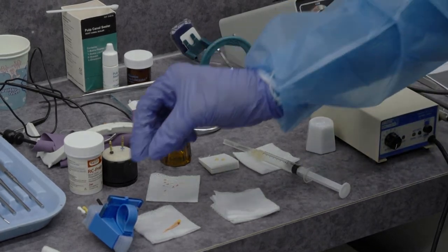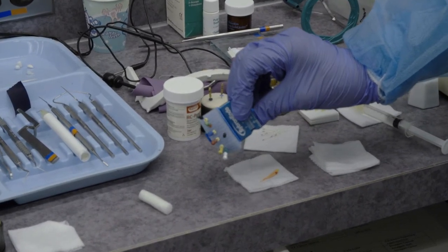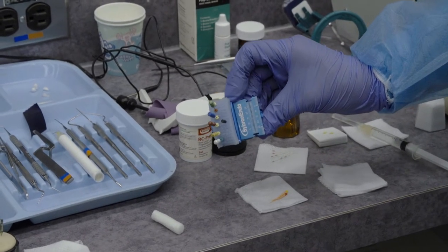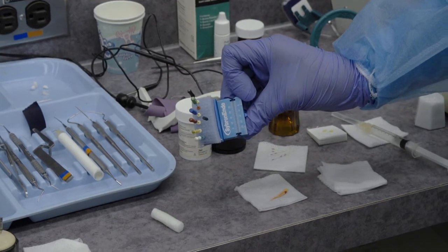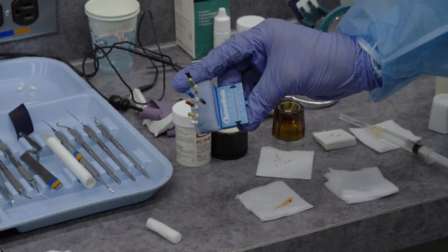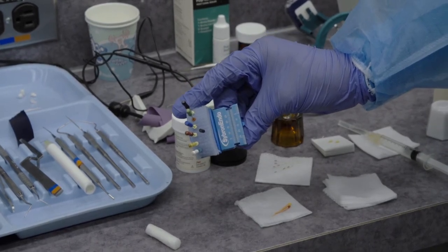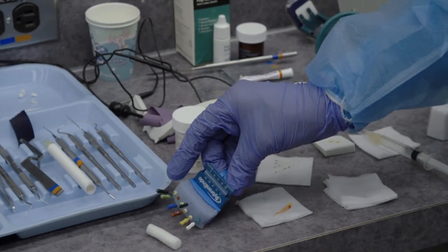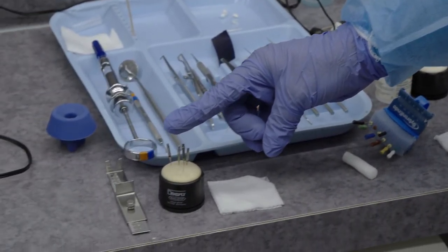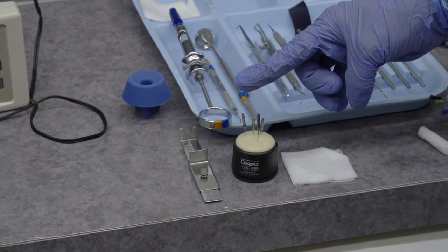We have a barbed broach that is set up here within the file setup. And I have here a finger file system that has the measuring device attached to it. And the endofiles we have from smallest, which is the white file, which is the 15 file, to the largest, which is the 40 size file. Over by the dentist, we have the lentulo spiral, along with a set of Gates Gliddens, which is size 2 to size 4.